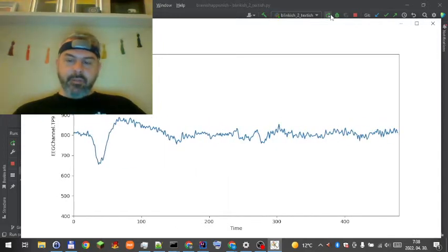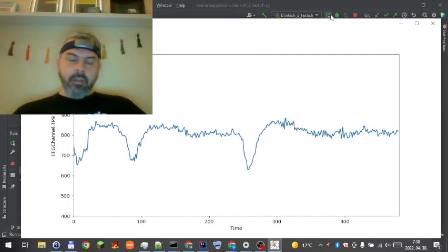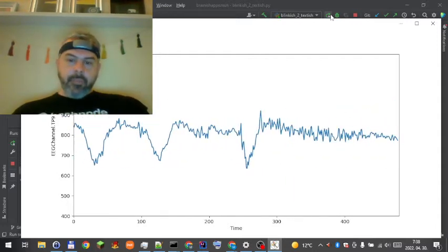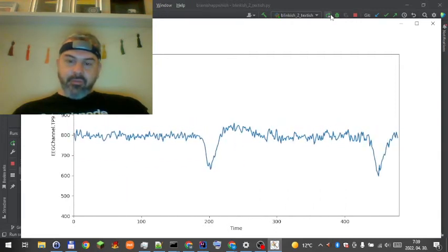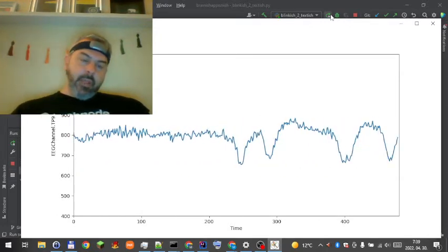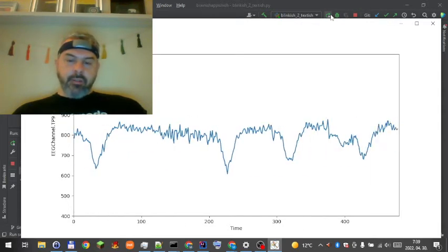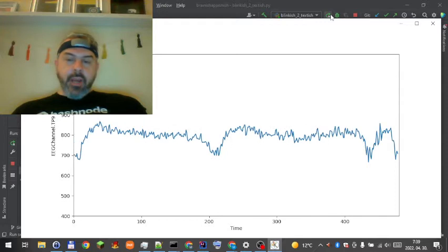Okay, so here it is. I have a Muse S EEG device. It has 4 channels, 2 frontal and 2 at the back, and there's some reference at the middle. And as you can see, this is just going and going and going. You can see on the y-axis the frequency, the amplitude, and on the x-axis you can see the time.